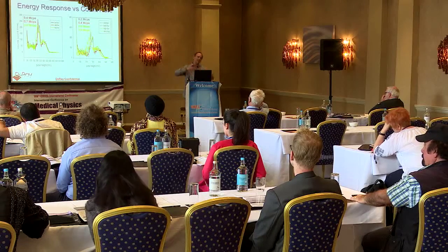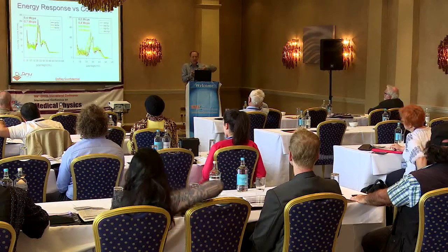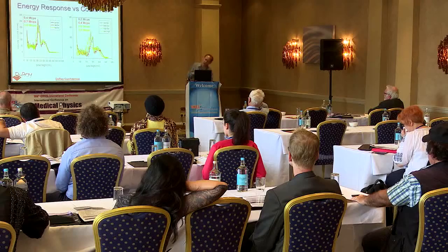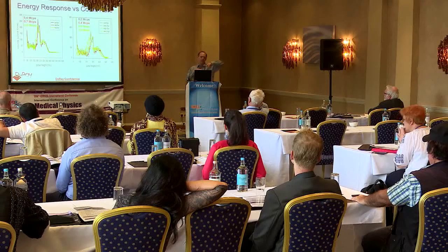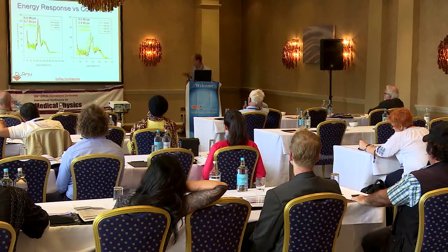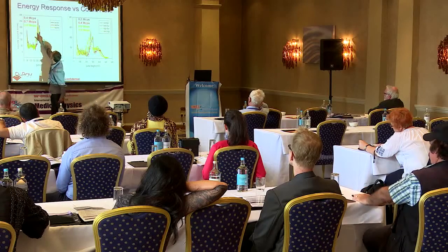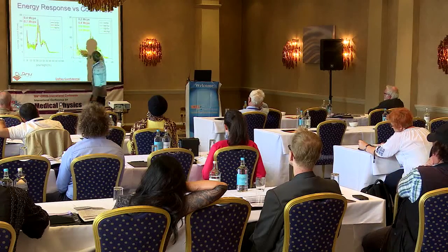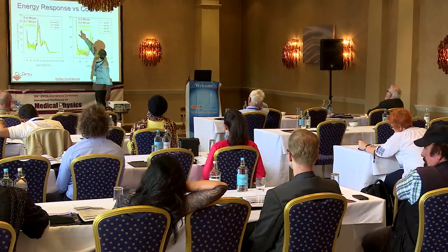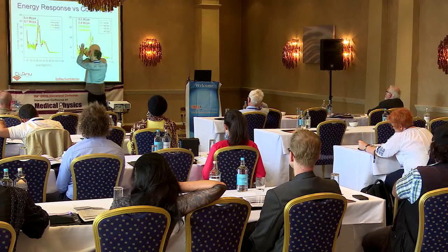Now this is a samarium simultaneous absorption and emission spectra created by taking a samarium filter and placing it directly on top of the detector to catch the fluorescence. Here you see the K alpha and the K beta peaks for the samarium, and you can see that at very, very high output count rate, near saturation, there is a shift to lower energy.